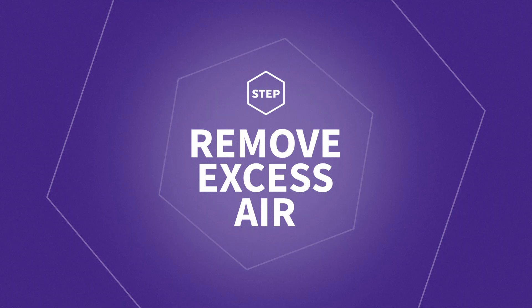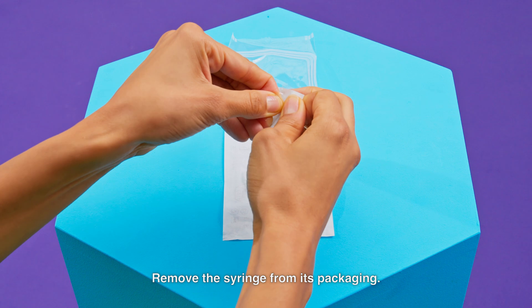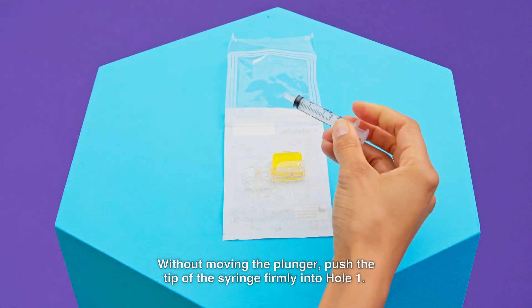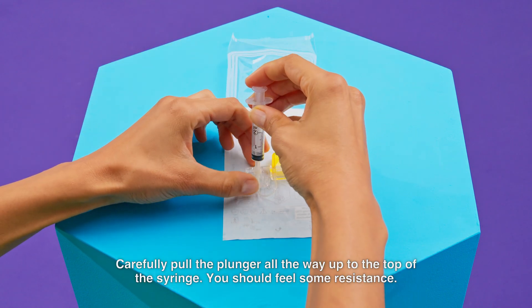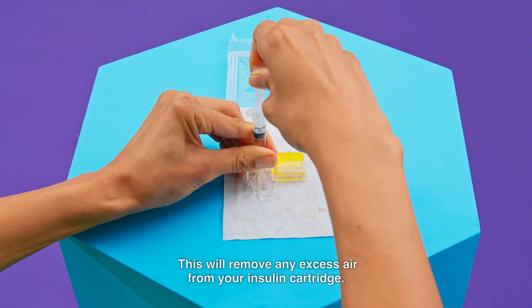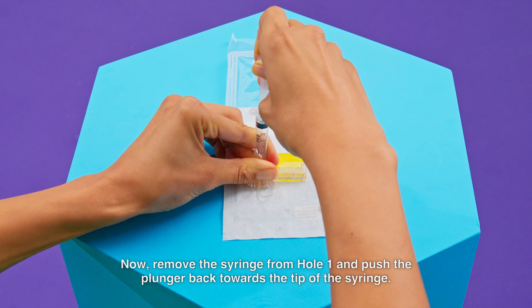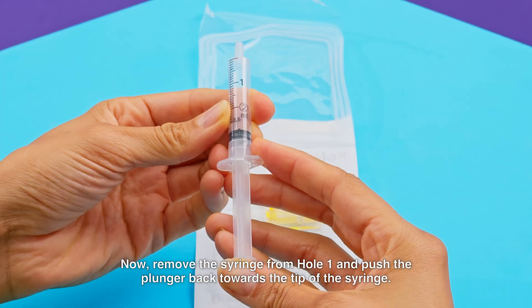Step 1: Remove excess air. Remove the syringe from its packaging. Without moving the plunger, push the tip of the syringe firmly into hole 1. Carefully pull the plunger all the way up to the top of the syringe — you should feel some resistance. This will remove any excess air from your insulin cartridge. Now remove the syringe from hole 1 and push the plunger back towards the tip of the syringe.